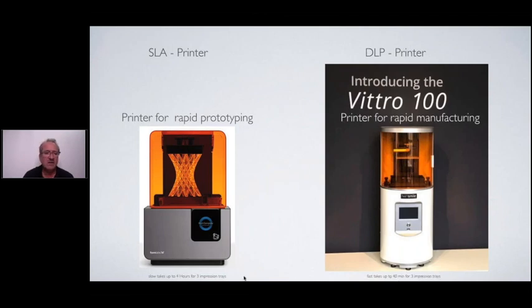In an SLA printer, it takes about 3 or 4 hours to produce them. So they're very, very slow, and that's why it's not feasible. But if you want to get started, it's very inexpensive. You can't do anything wrong with something like this. But for the next step, you have to decide on something that you can do your daily work with.